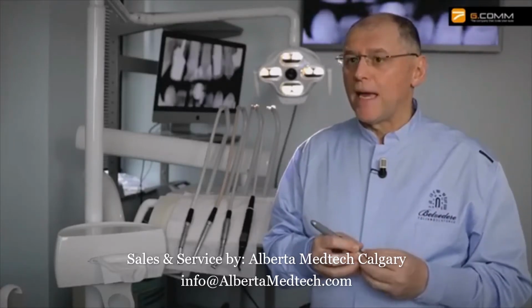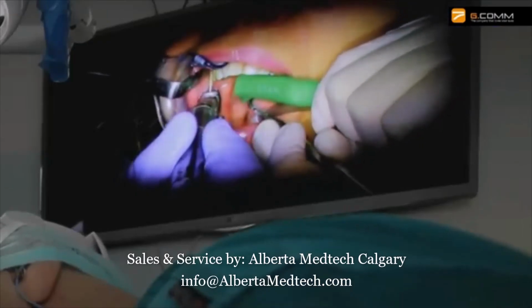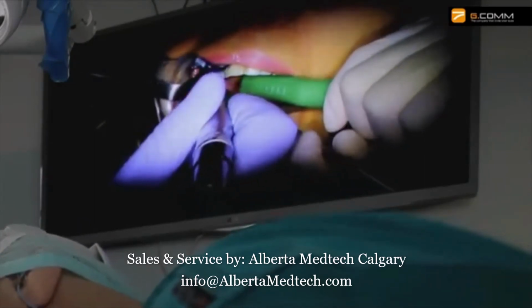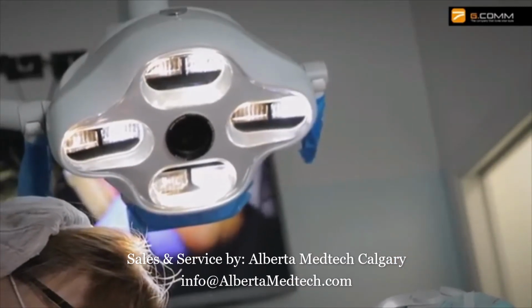Another fundamental aspect is the fact that this type of solution avoids the annoying vibration during filming typical of a video camera not mounted on a fixed system. Naturally, in the systems we use for seating the patient in our chair, the lamp must be independent and not positioned on the chair itself. Therefore, if we have a system that allows this, a lamp with an incorporated video camera becomes the ideal solution.